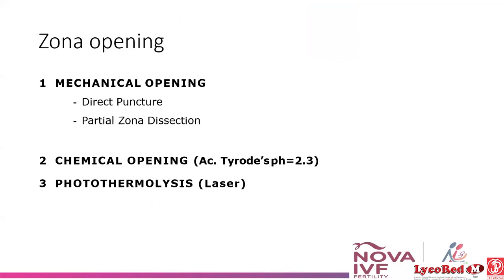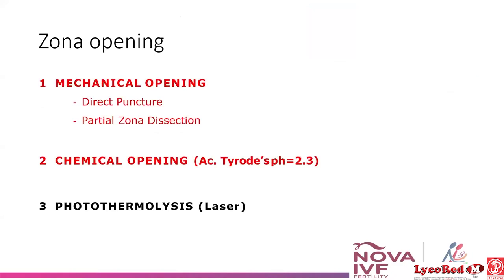So first of all, zona opening. For zona opening, there are 3 techniques: mechanical opening, chemical opening, or photothermolysis. The mechanical opening and chemical opening are outdated. Nobody is using them. But nowadays, we all are using photothermolysis, that is laser.